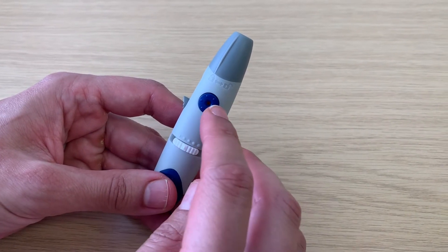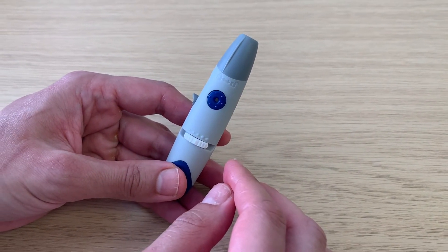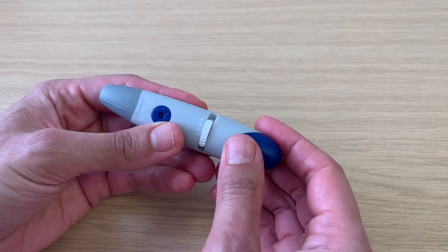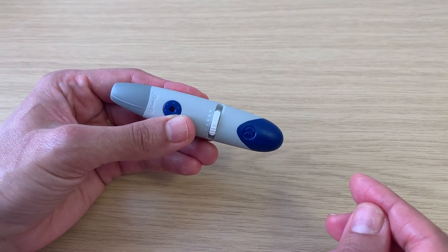The round blue button fires the needle. To reload the spring and fire again, hold the lancing device in the middle and pull back on the blue end until you hear a click. Now the needle is loaded and ready for you to take a measurement.